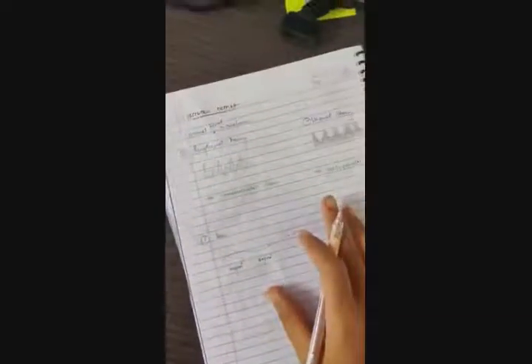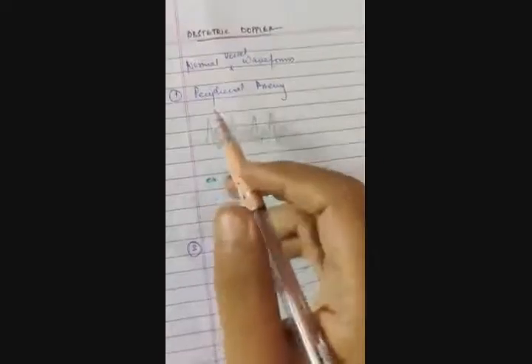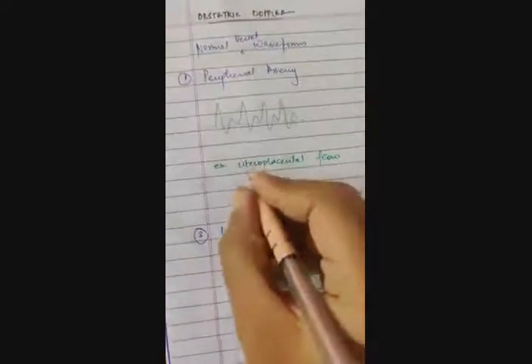So let me walk you through the basics. These are three basic vascular waveforms in radiology. The first two are very important for us. So when we're talking about a peripheral artery, you can imagine the probe on, say, the femoral artery, or in our case, very important to know.